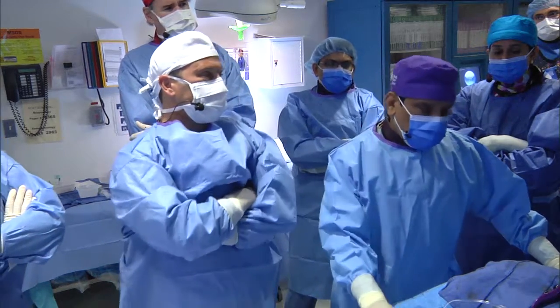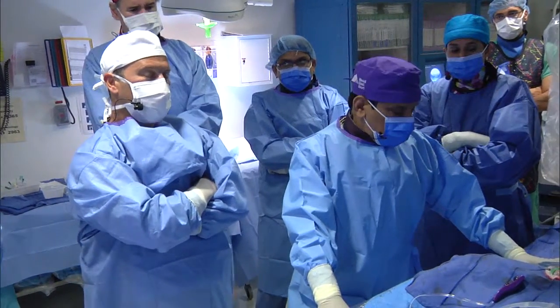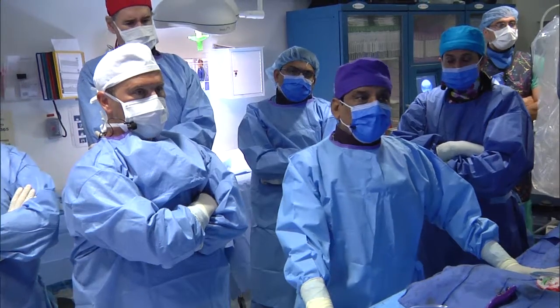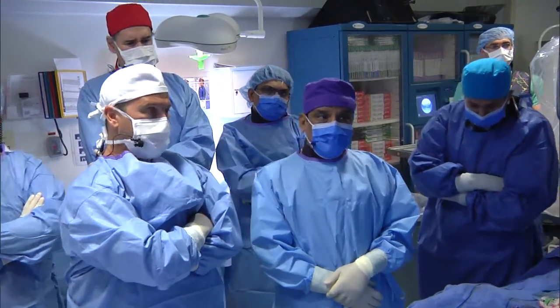And I think that's the important point, and the whole decision making will become a little more clear once we give the long-term data of the TAVR valve endurance, that they perform well at 8-10 years. I think that's where it still remains.